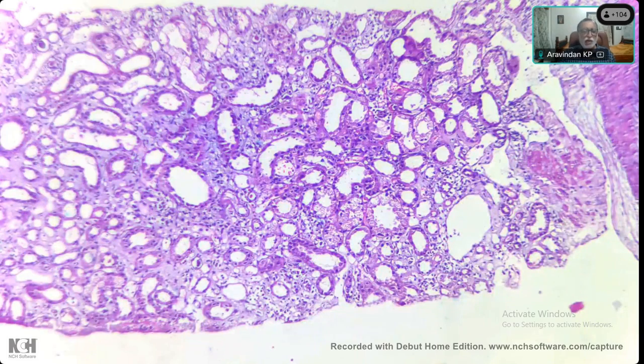So here, is it due to edema or fibrosis? Here I can see edema and some inflammation. You see this bluish material here. Okay, good. What else in between these tubules? Some inflammatory cells are seen, sir. Uniformly, there are sprinklings of inflammatory cells all around. Mostly, I think, lymphocytes. Yes, sir.